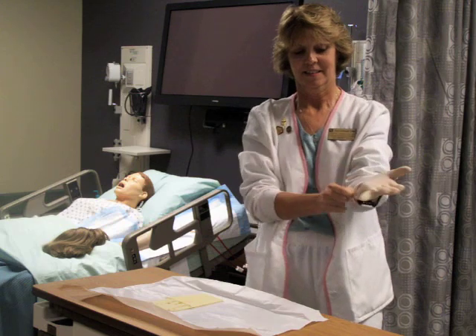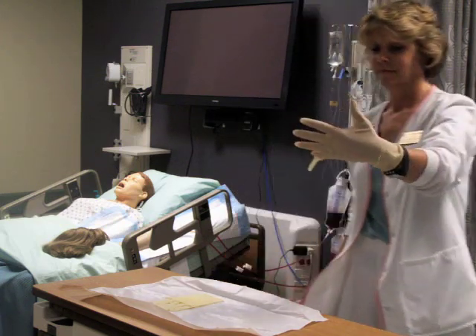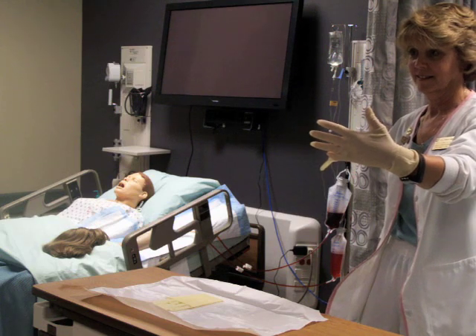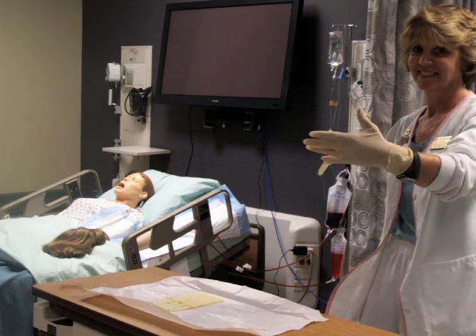Let gravity be your friend. If the glove does not go on completely and adequately, not to worry — the next glove will be able to use its sterility to adjust the glove placement.